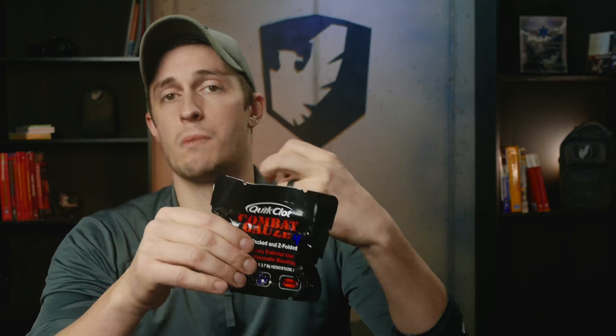That is what it looks like when it comes out of the package. Now, this package is vacuum sealed, so it's much thinner in packaging. It also has these little tabs all the way around it, so it doesn't matter which corner you grab to tear. When you need this and your hands may be bloody, you grab it, you tear, and it's going to open at any one of these corners. Then you'll have that gauze in there.